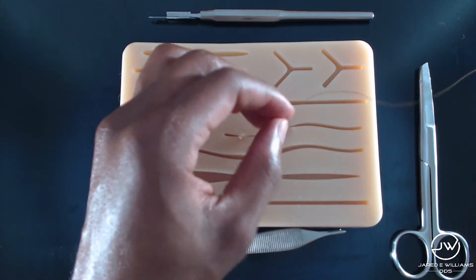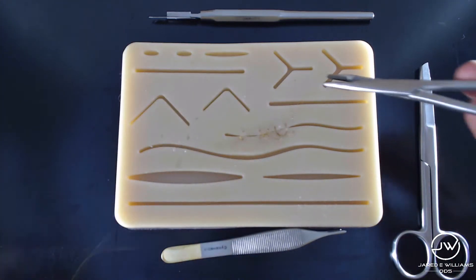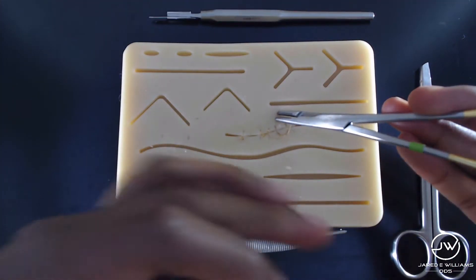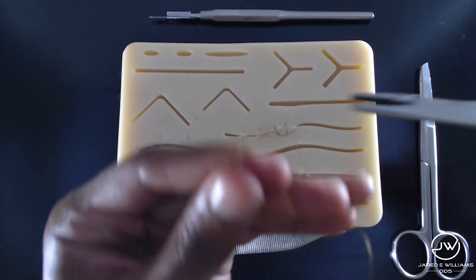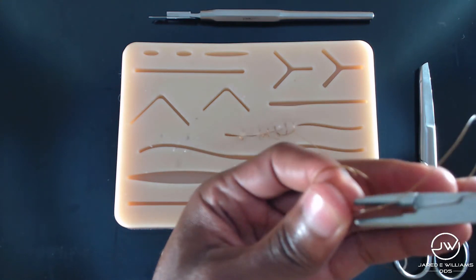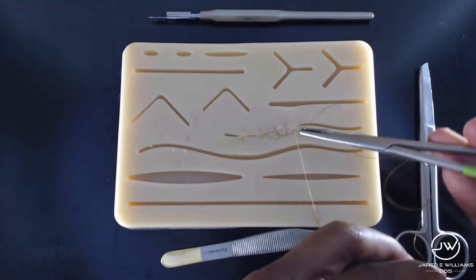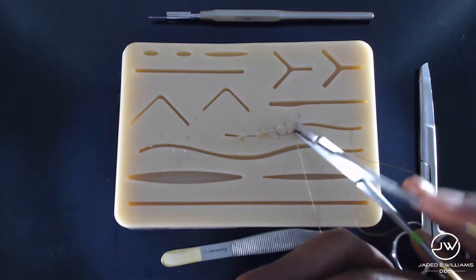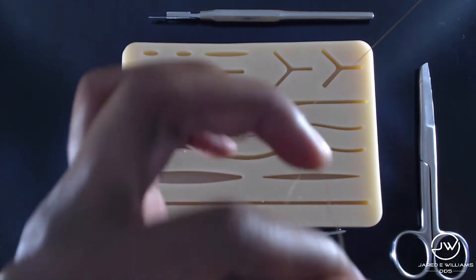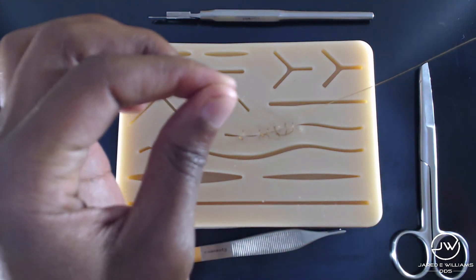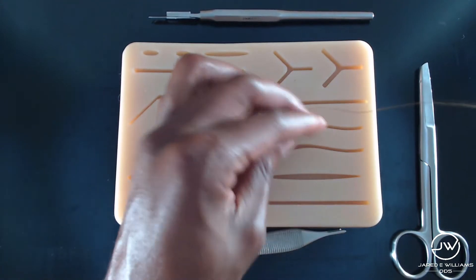So, I want to turn it on its side. Bring the back end of the suture through it. See how we're starting to form that continuous suture there? Continuous locking suture. Make sure that your tail isn't too long or you're going to get knots. So, you want to bit it about an inch.